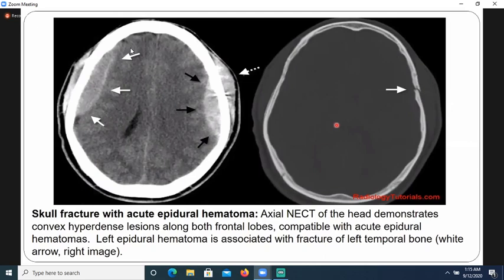This is the CT scan brain window, and this is the bone window. In the bone window, we only see the bone. All other structures are obscured. And in the brain window, we see the brain parenchyma. There is a biconvex hyperdense lesion in the frontal lobe with a mass effect over the ipsilateral lateral ventricle, and there is also soft tissue swelling of the scalp tissues, which is also white, hyperdense.